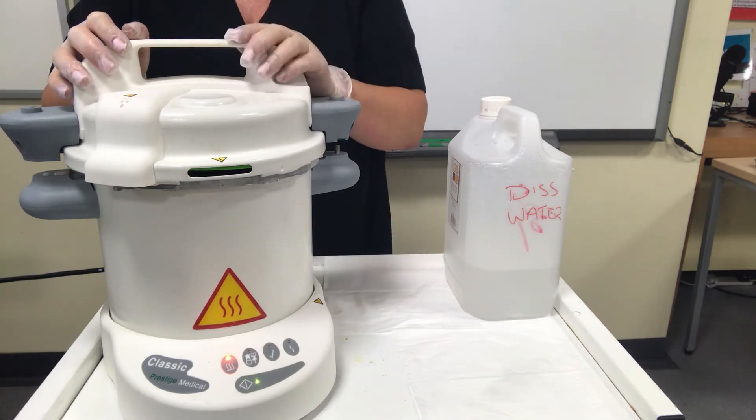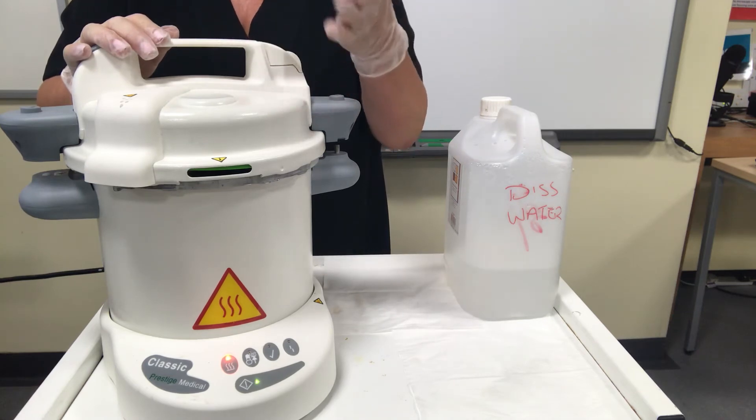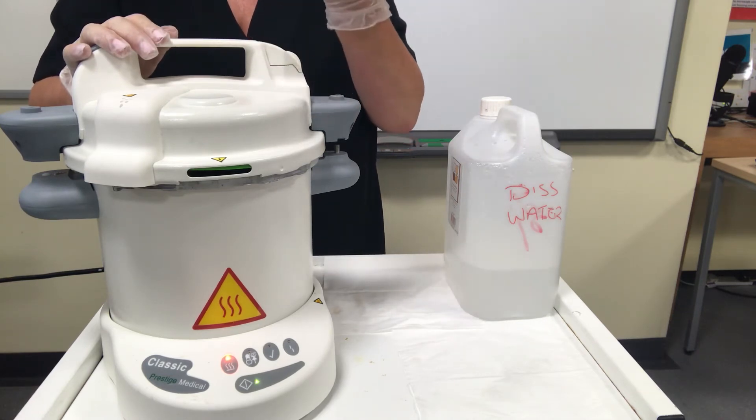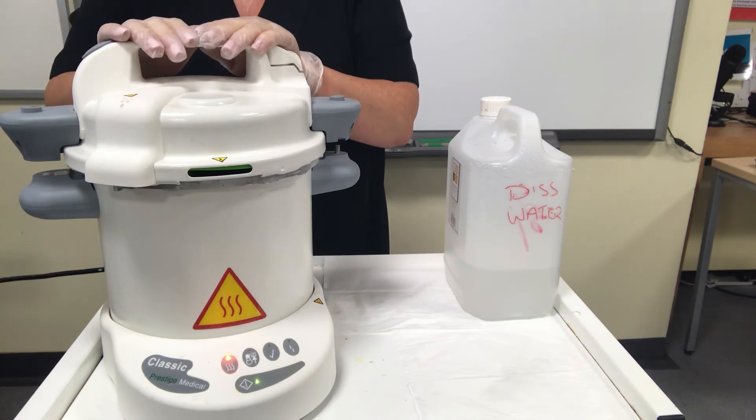Because it takes 10 minutes, this must be the first thing that you do when you come into your treatment room or salon. Put all the tools in here first of all and then they'll be ready and cooled for when you come to use them.